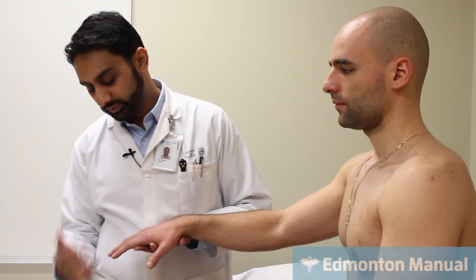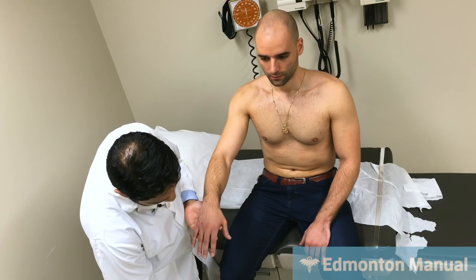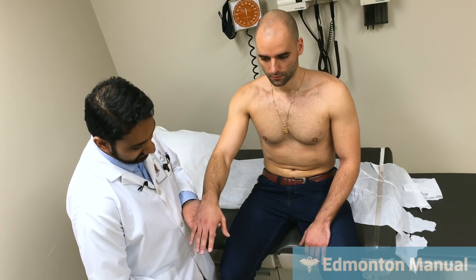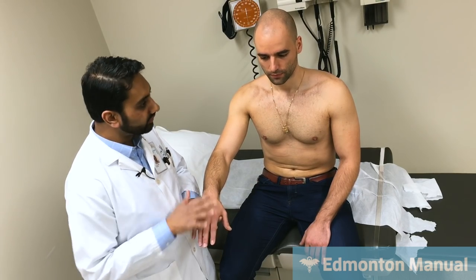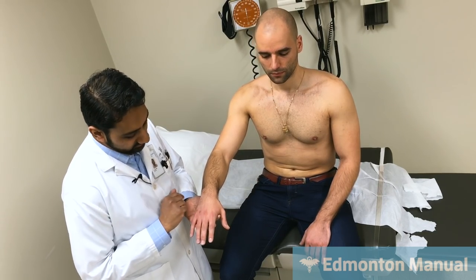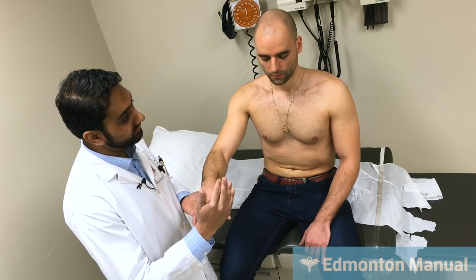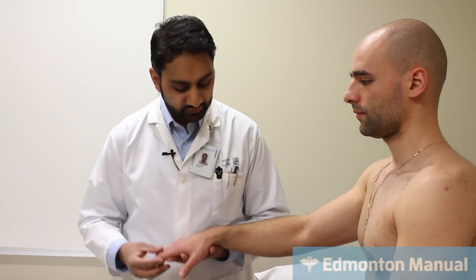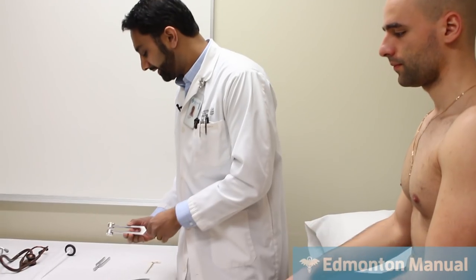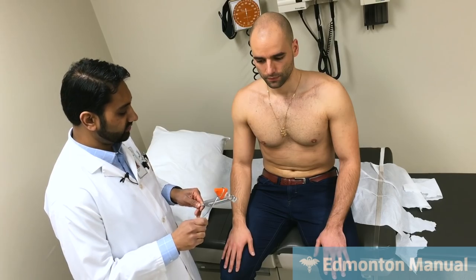As a general rule, when people have the classic glove and stocking distribution, it's usually the numbness or the paresthesias or the decreased sensation has to reach, I believe it's about the knees, before you'll start to get any problems with the hands. That has to do with fiber length, okay? So again, what we're going to demonstrate on the fingers is the same thing that you would do over the toes in a diabetic foot setting, okay? Now, the first thing you should always do with vibration testing is make sure that the patient can actually feel the vibration on a very proximal surface. So again, hitting it.